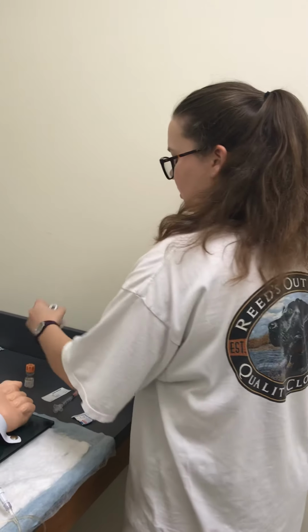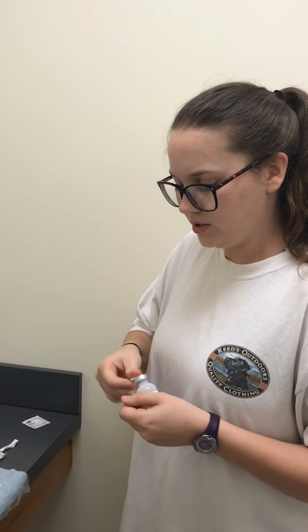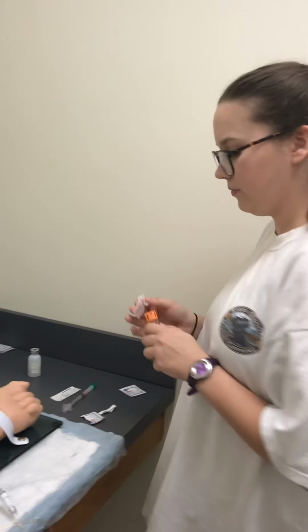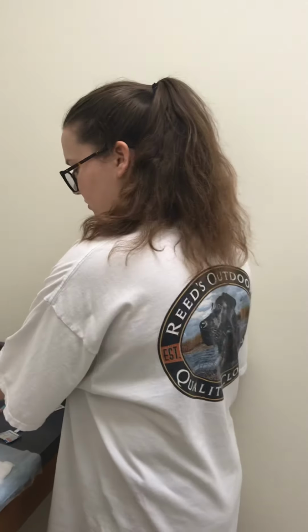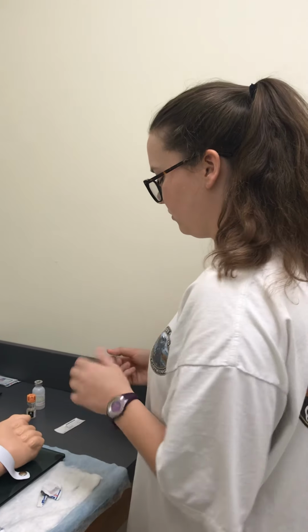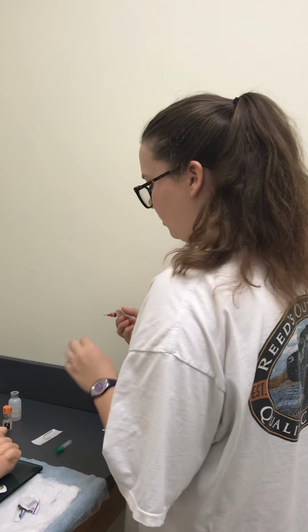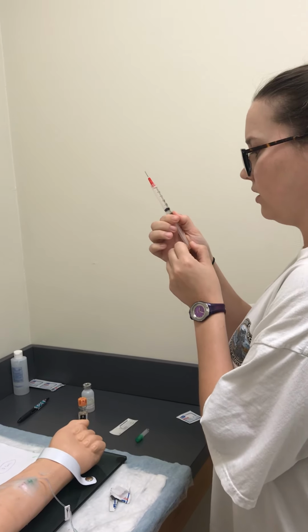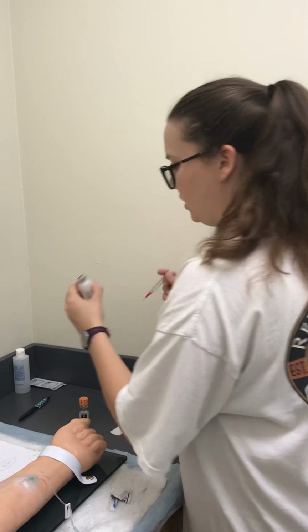Okay, I'm going to scrub each top for 15 seconds and allow them to air dry. Okay, I'm going to administer first into my diluent, and that's going to be 2.7 milliliters of air.